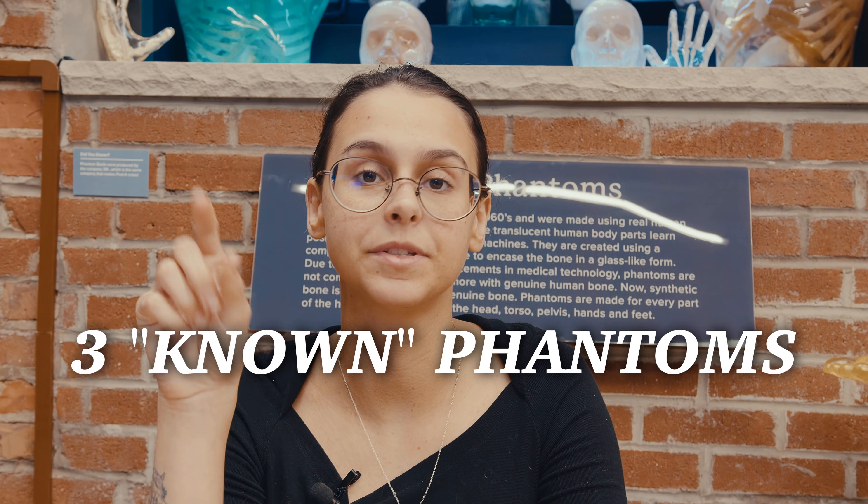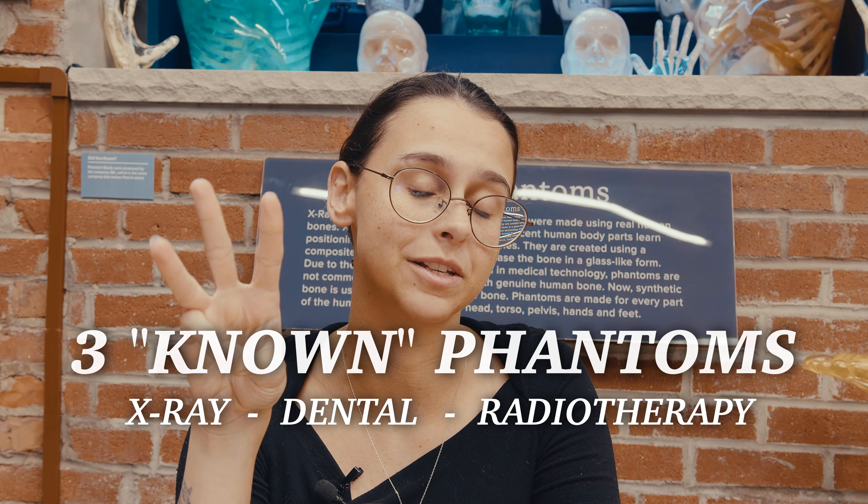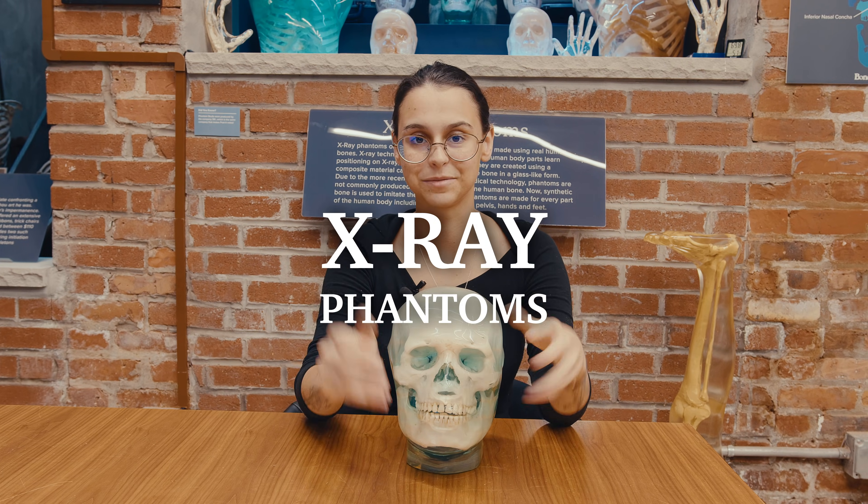Now, there are three types of phantoms: X-ray phantoms, dental phantoms, and radiotherapy phantoms, and they all serve a different purpose. And we're going to start with X-ray phantoms.